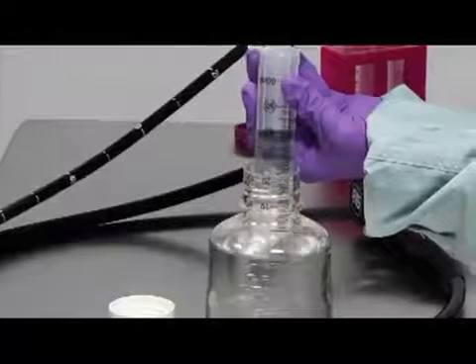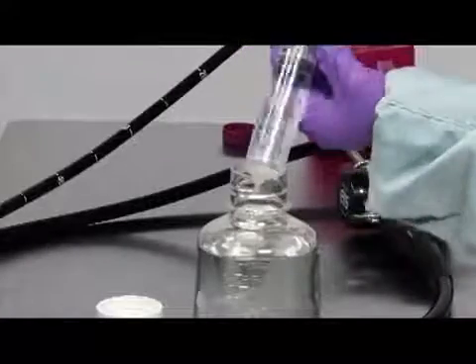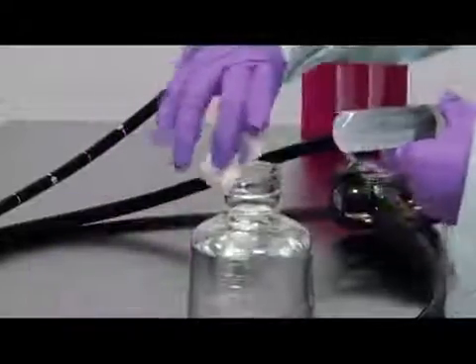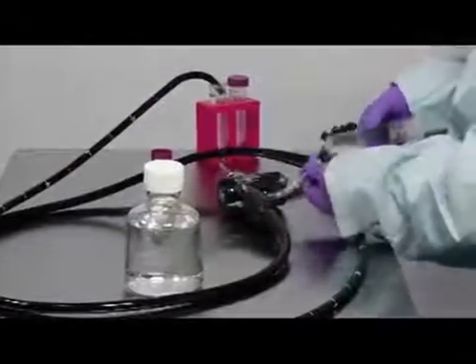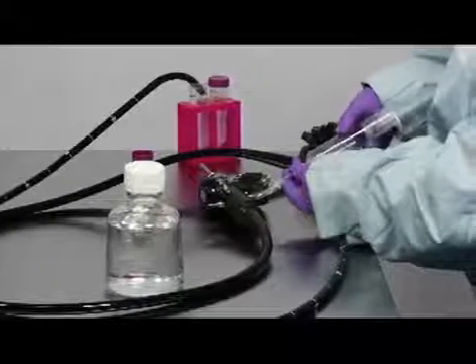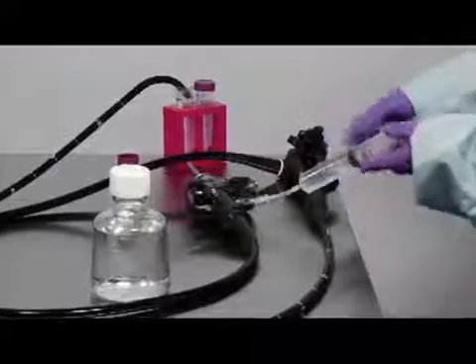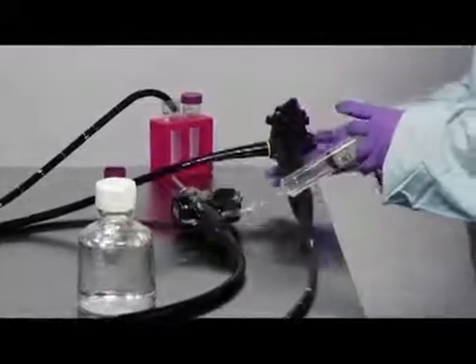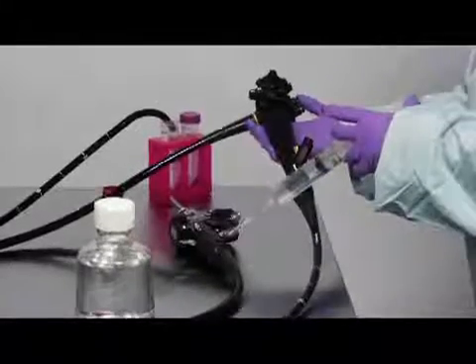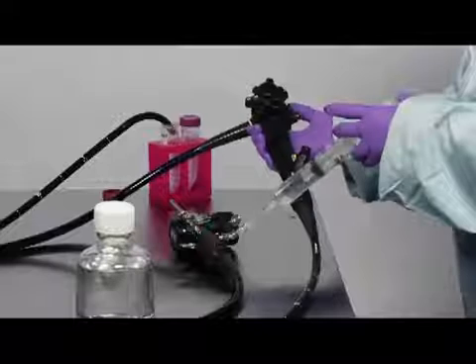So once you've pulled up your 40 mils of water, you then want to take this syringe and connect it to the connector that's on the light guide end. Now here, for purposes to show you the camera shot, we're picking up the control head to actuate the suction valve. This can actually be done while the endoscope is laying flat on the surface.